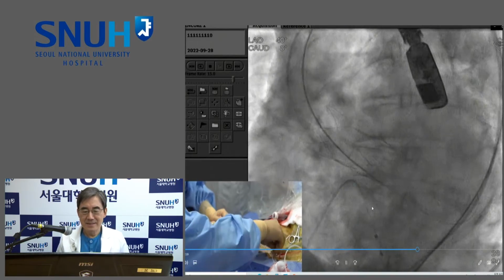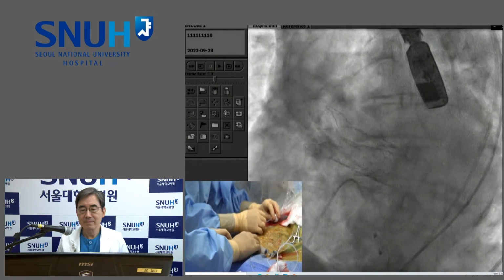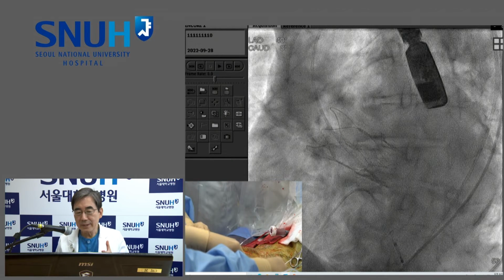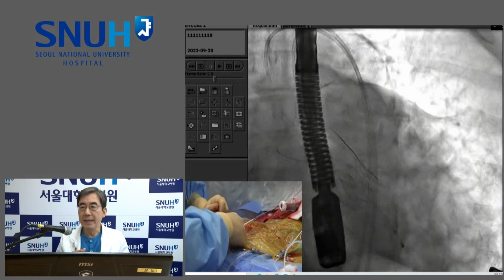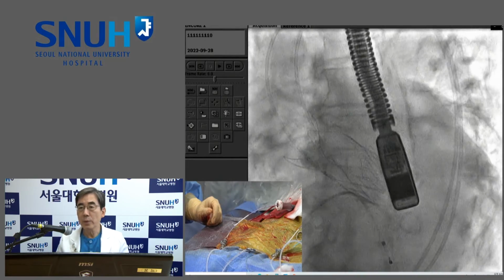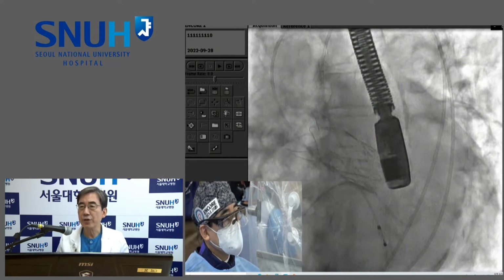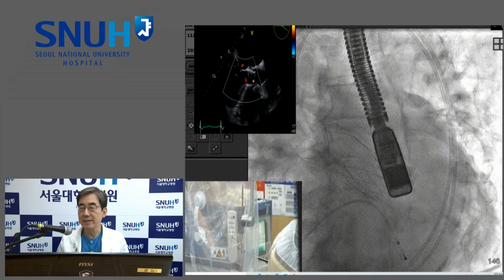So, Professor Kim, this is David Cohen. You've obviously not done very many of these, but what anatomy or type of patient would you think would not be well suited to a Neo? Are there cases where you think that's just not the right choice, other than size mismatch where it doesn't fit? As I mentioned before, it is not retrievable. Thus, if the anatomy is very tough, it may hinder optimal positioning after deployment of the upper crown or stabilization arch, and then we cannot retrieve. Thus, we have to deploy at a non-optimal position. So if the anatomy is too tough, I think it is a little bit tricky. But in other cases, it has strong points from Sapien as well as from Evolut, as I mentioned before in the slide.